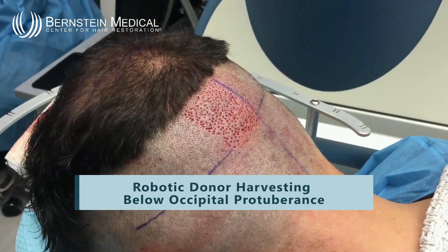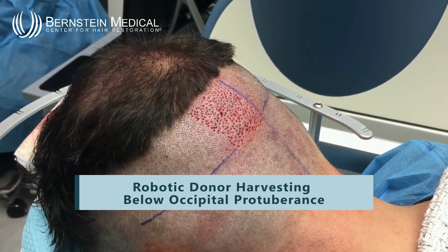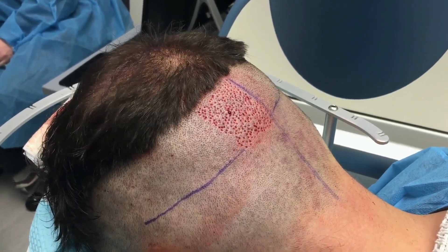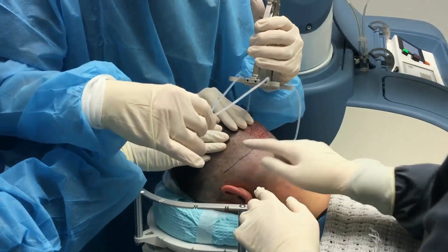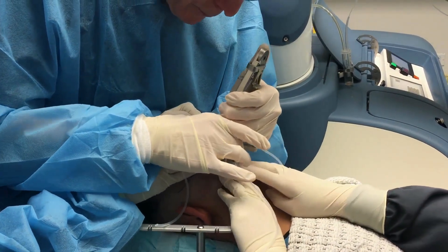The purple gentian violet line runs exactly through the level of the occipital protuberance. The first two grids were above the occipital protuberance. I used a 0.9 millimeter punch at 1.7 millimeter spacing and a two-pass technique.